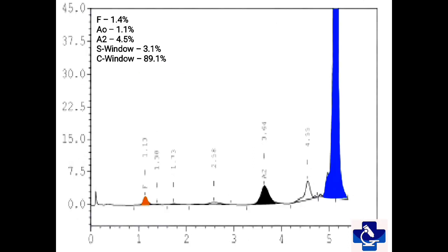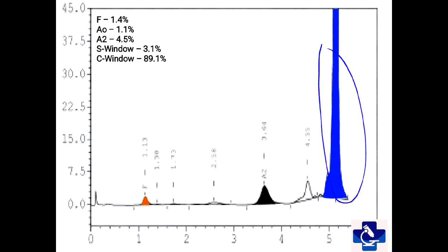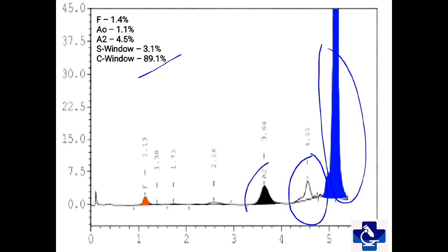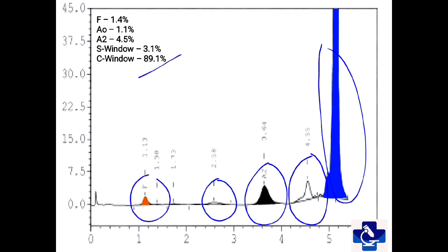In this HbC graph, we can see that the C window has the major amount of hemoglobin near about 89.1%. We have the S window having 3.1%, which is the post-translationally modified hemoglobin C. HbA2 is mildly raised at 4.5%. A0 is 1.1%, which is actually modified hemoglobin C, and hemoglobin F is mildly raised at 1.4%. So this is a case of homozygous C.